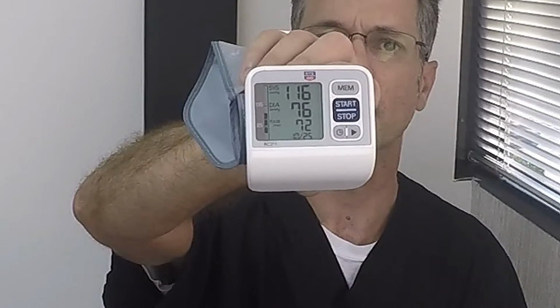So you can see my blood pressure was 116/76 with a 72 pulse, right there. So that's about usually what I run for the middle part of the day. And also, I did not mention this, but always do it on your left hand or your left arm for greater accuracy. Now this, like I said, will have a memory. This will remember the last 15 times that I checked my blood pressure. But I personally don't use that.